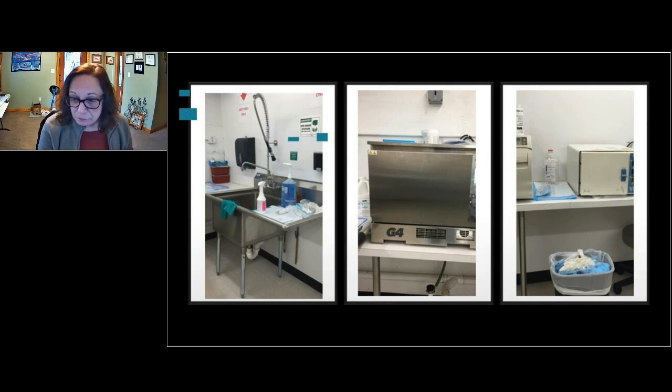Now, this washer, you can see it's on a table, so there wasn't any countertop there for them to dry their instruments or package them. So what they ended up doing was extending their dirty area to the right of the sterilizers, designating that area dirty because this washer does not decontaminate or disinfect the instruments. They would still have to wear PPE in that corner of the clean side to prepare, inspect, and package the items, and then they could put them in the sterilizers. This was not the best setup, but given the space that they had, this was probably the best they could do.